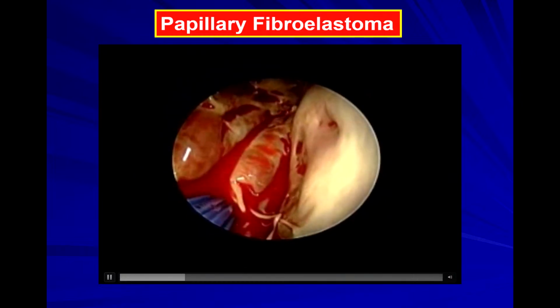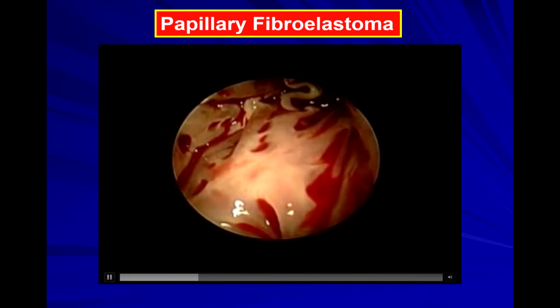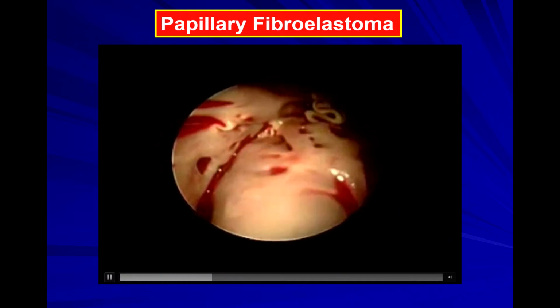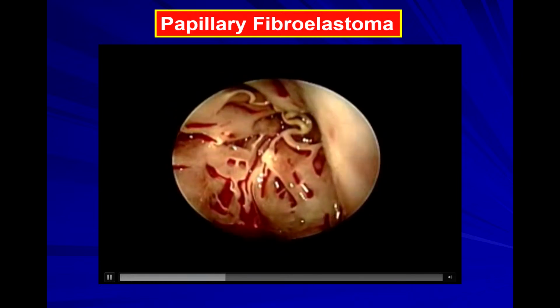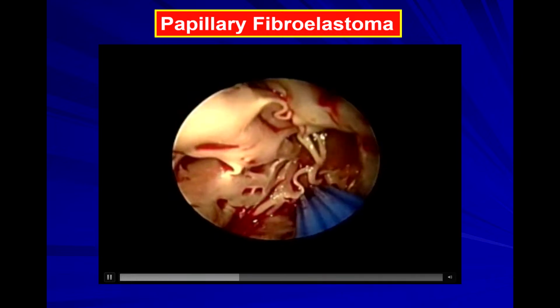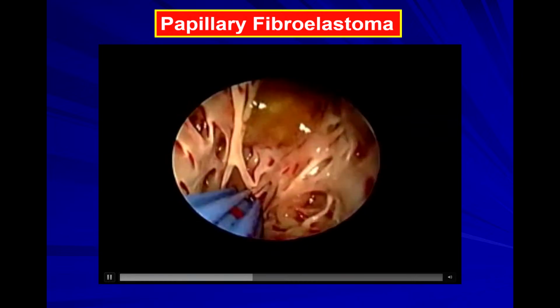This is our first view. So we're inside the left ventricle. We see lots of trabeculation. We're searching. It's not obvious where that mass is. He's searching, still hasn't found it. So obviously it's not hanging or floating around loose in that left ventricle. Oh, there it is. See it? Right there. It's that very yellow, mucinoid-looking mass.